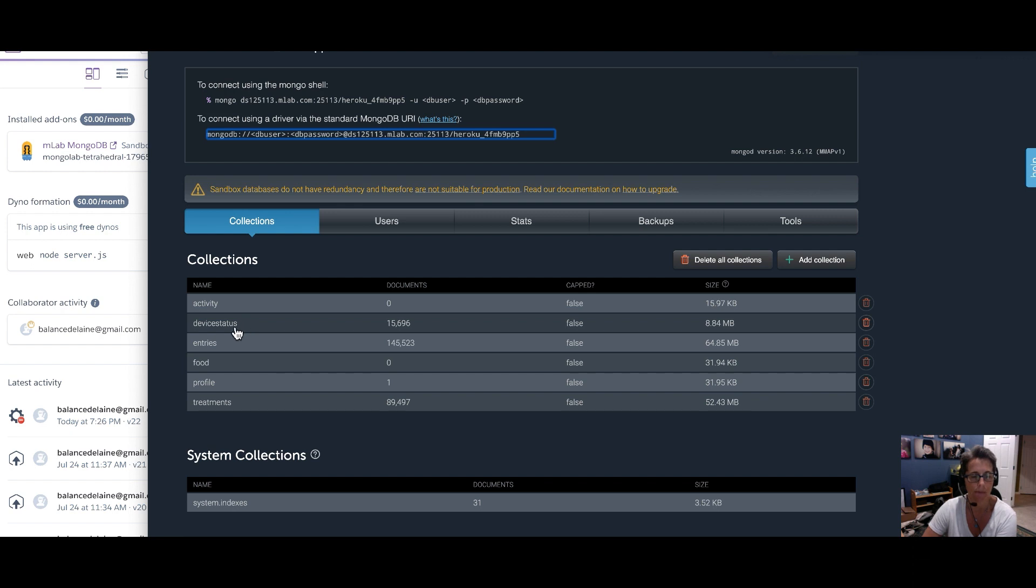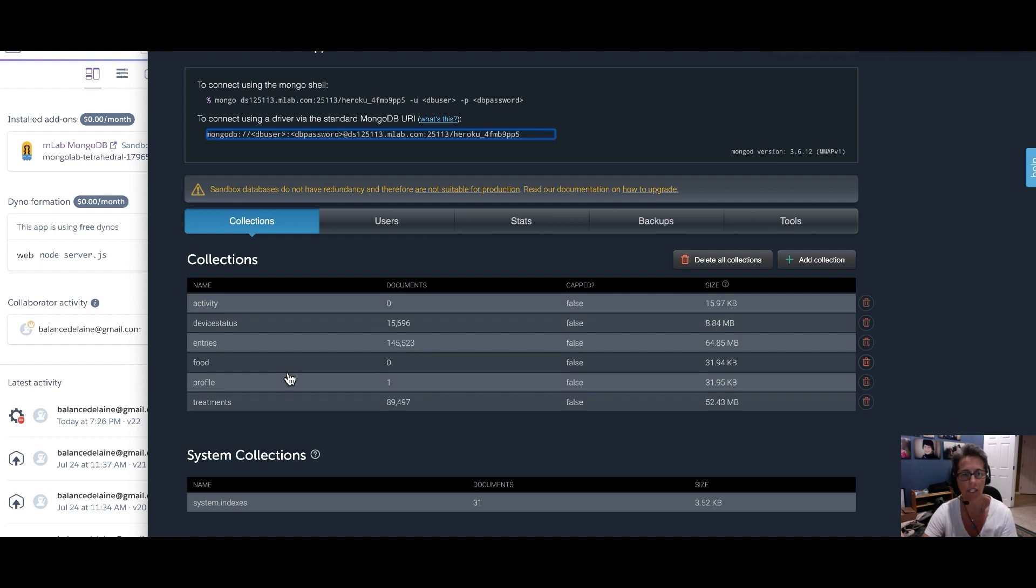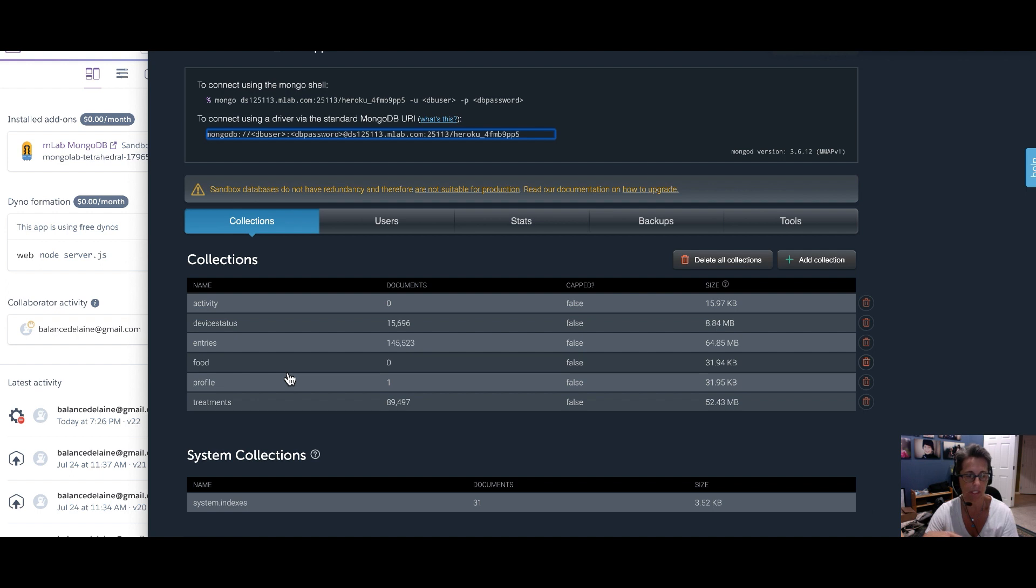So device status is things like your loop. It's how the prediction line is going, how your loop pill is, how your pumps are, all of that kind of stuff is stored in device status. Entries are your CGM readings. And treatments are your insulin, carbs, temp targets, temp basals, all that kind of stuff.